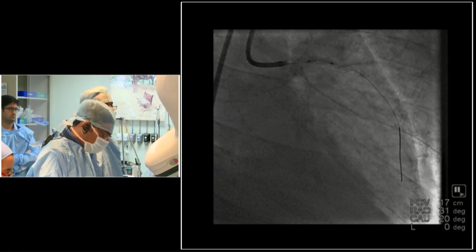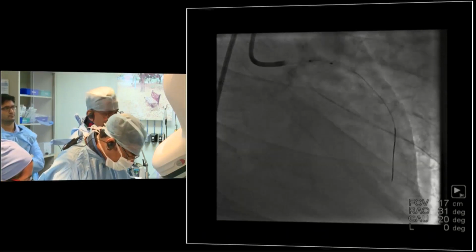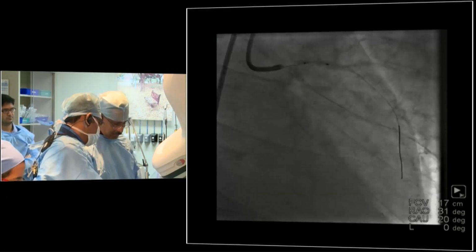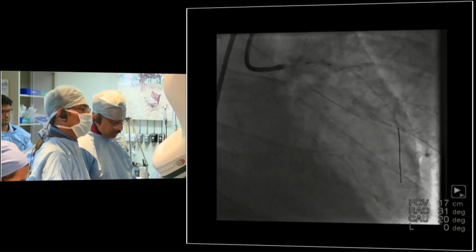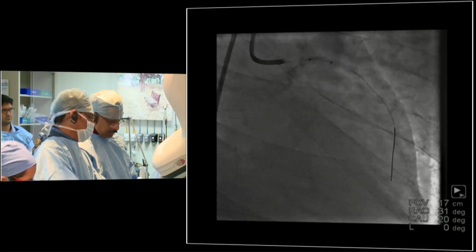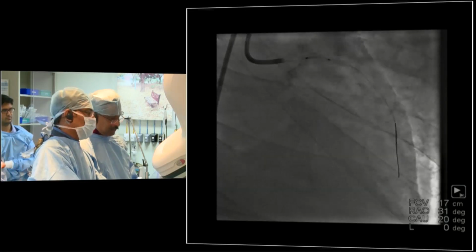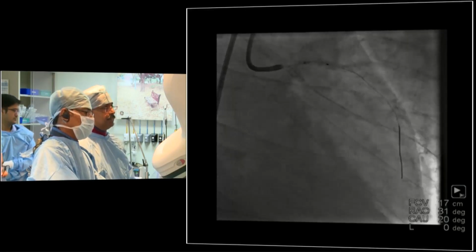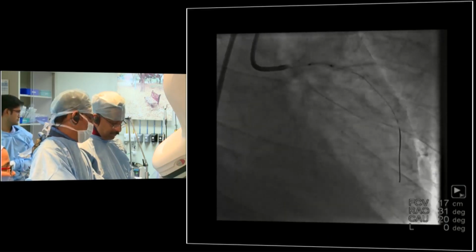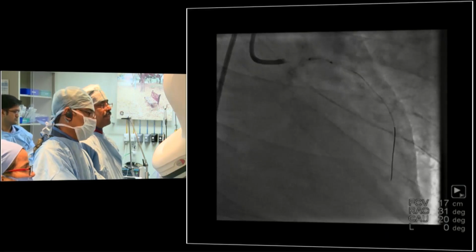Dr. Ajit, are you not planning to stent the OM from circ to OM? Because this patient had a lesion. Not really, not now. But this will invariably lead to LM stenting also, hopefully, because the lesion probably starts from the ostium. Yeah, that's exactly what we discussed now.